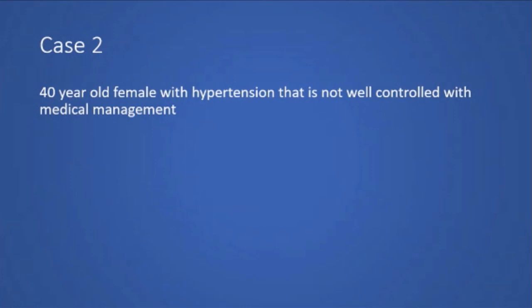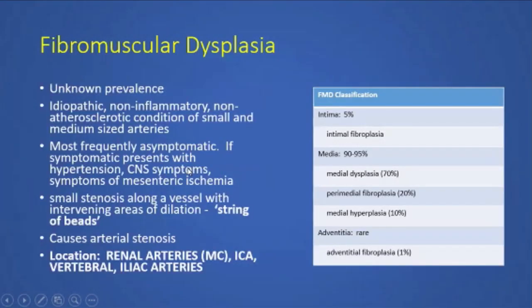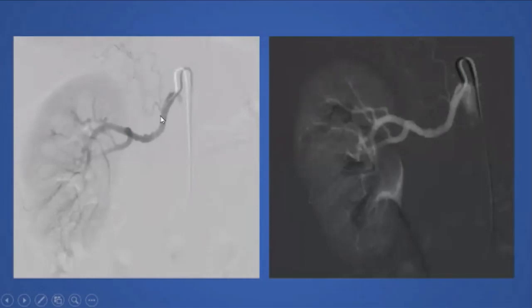The next case is a 40-year-old female with hypertension not well controlled with medical management. We took this patient to angiography and used a reverse curved catheter to select the renal artery. Digital subtraction angiography demonstrates multiple abnormalities — multiple areas of narrowing followed by dilation — a pretty classic appearance for fibromuscular dysplasia, with alternating areas of stricturing followed by dilation.